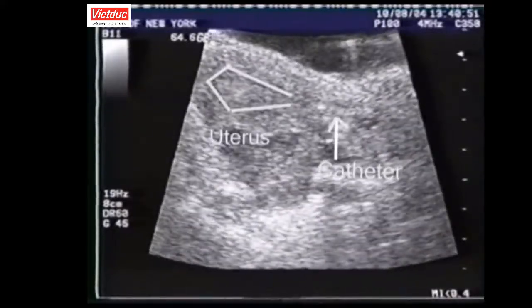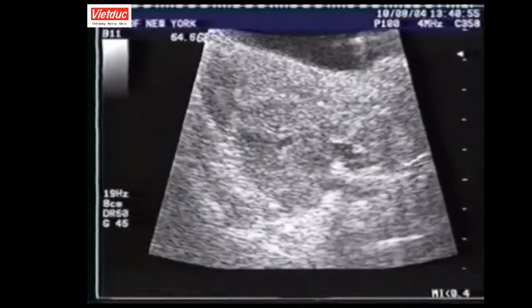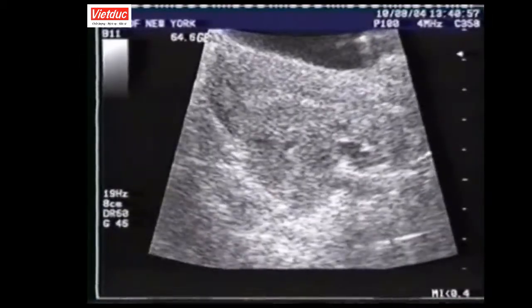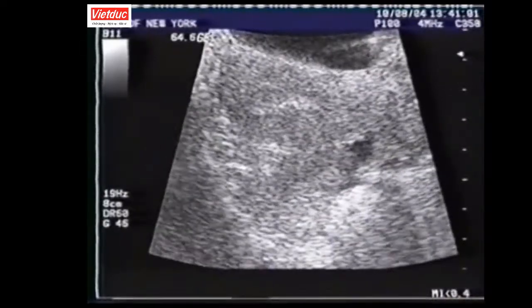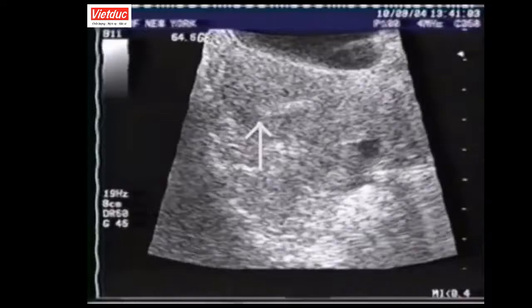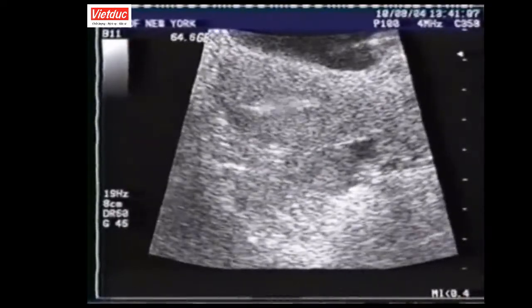You can see the catheter on the top right side of the screen making its way into the uterus, which is on the top left. The embryos are then deposited and the catheter removed and checked to make sure all the embryos were placed in the uterus.